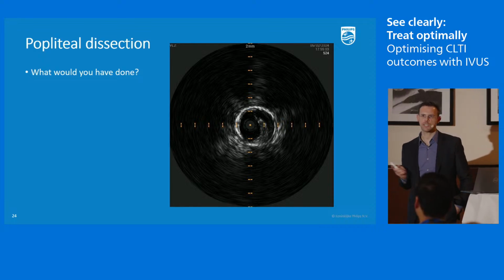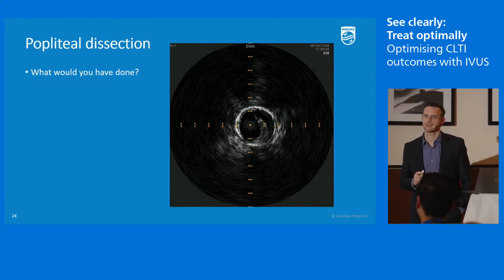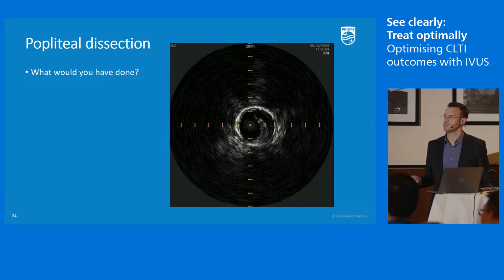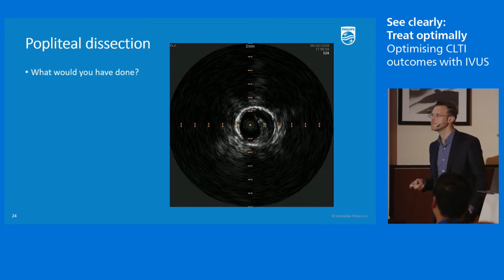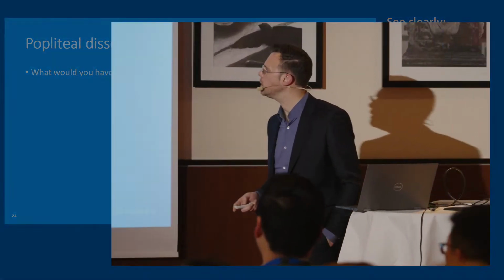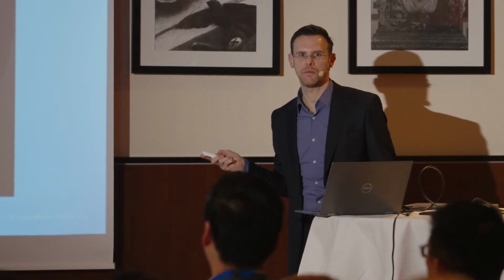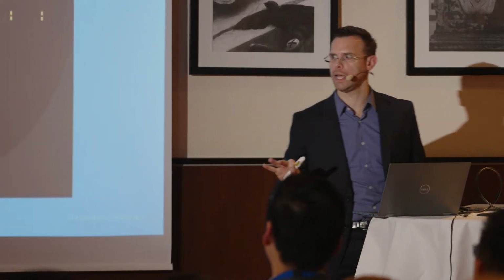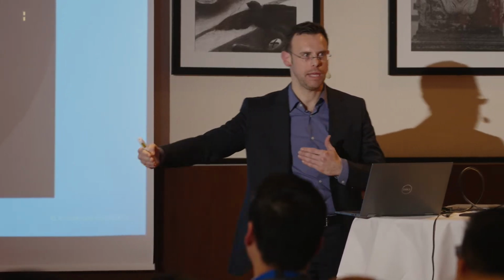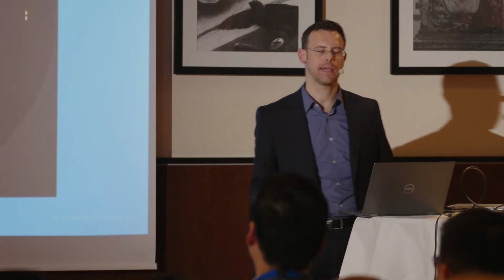Everyone have a guess of what that classification would be? Go on, have a guess. It's either a 1A, a 1B, a 2A, 2B, I would say. What do you think? Think 2B? I made that a 1A. I thought that was less than 180. It was about just less than 180 degrees and into the intima. So I actually left that. But as NT said, there isn't actually a validated way of us being able to ascertain what the outcome is as a result of this classification. And until we get that, it's going to be useful only in descriptive rather than predictive terms.